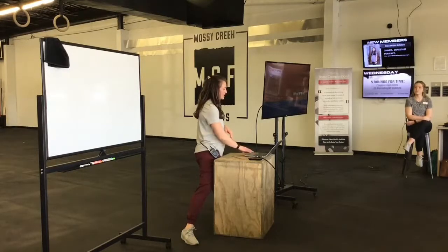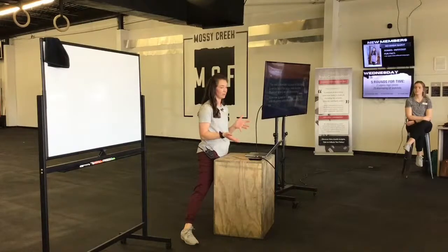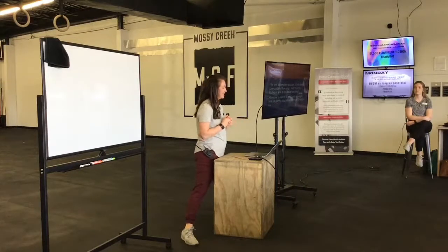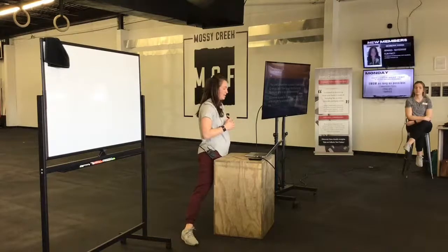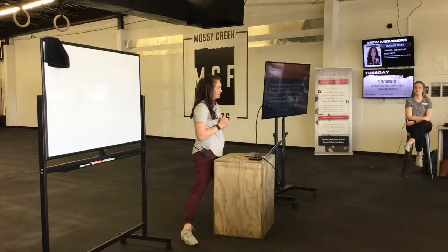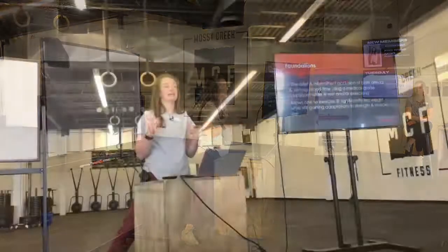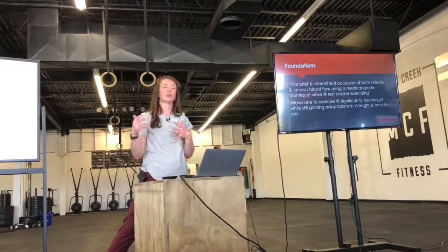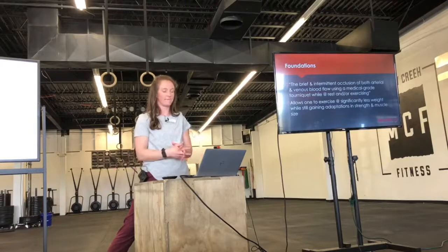So first, let's define blood flow restriction training, because there's a lot of us in here that don't even know what it is. BFR, that's what we're going to call it for short, because I don't really want to say it multiple times tonight, is defined as the brief and intermittent occlusion of both arterial and venous blood flow using a medical grade tourniquet while at rest and or exercising. So BFRT allows us to exercise at significantly less resistance while still working towards strength adaptations, okay?